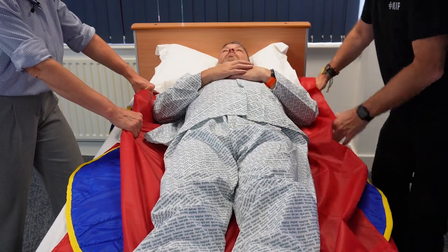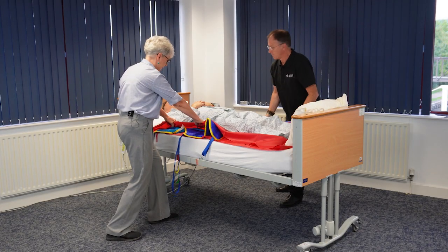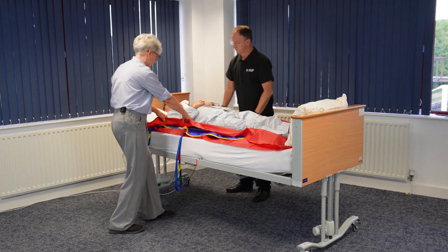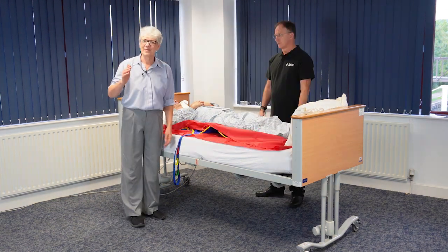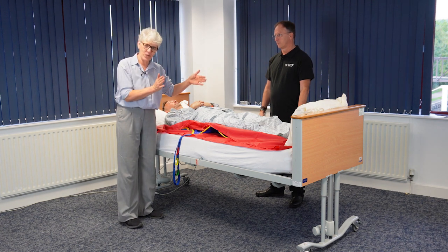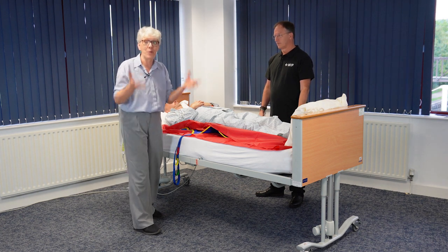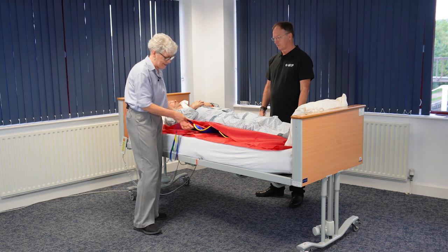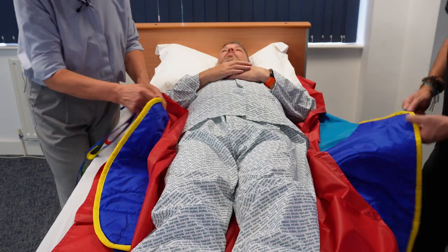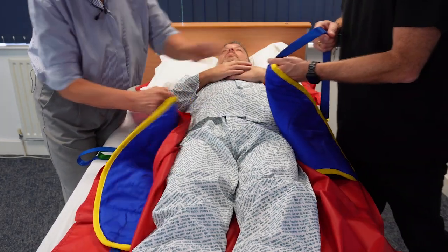Both of us standing in a step stance. We need to ensure that Colin is positioned centrally on the sling to make sure he's comfortable when we hoist him. To do that, get the hip portion of the sling and just hold it up — you'll see that we've not quite got it even here.